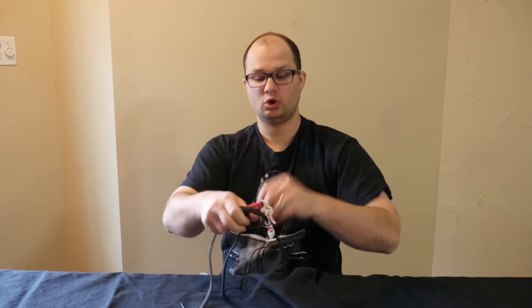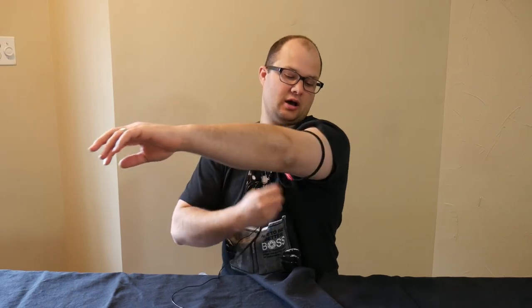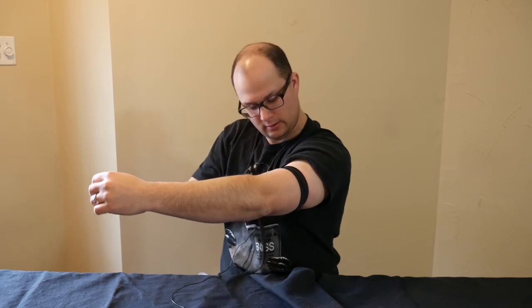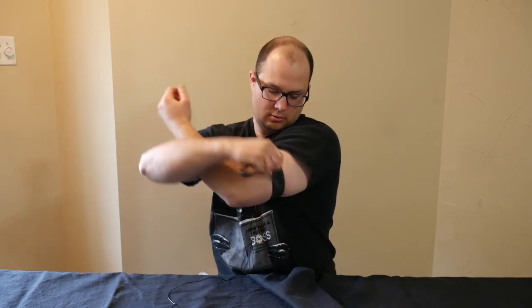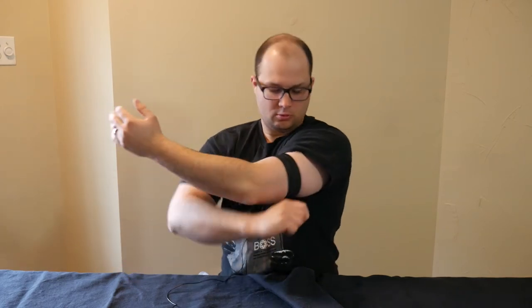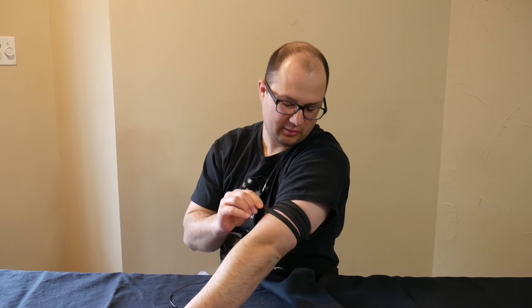One thing you could do to try to mitigate that problem is to wrap the tourniquet as tight together as possible — so all the tourniquet is lined up better to not have those compartments. You could attempt to do that.